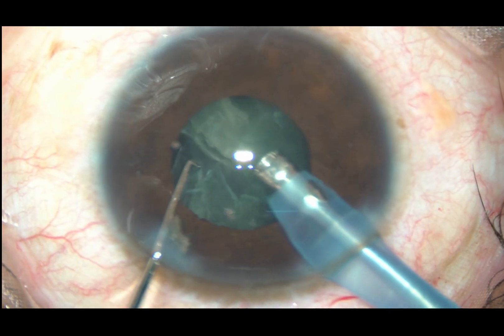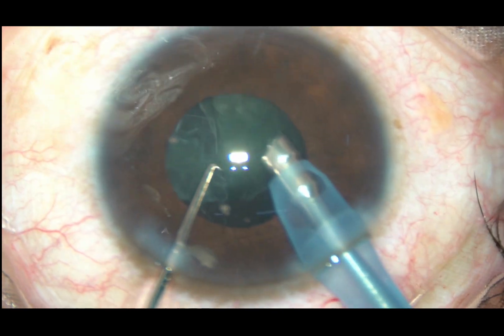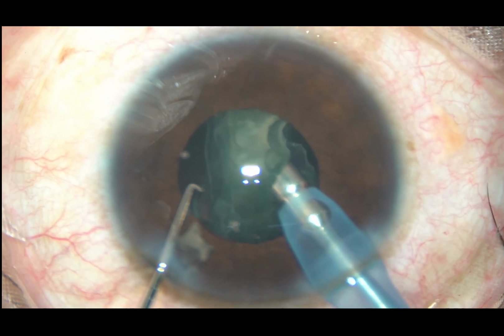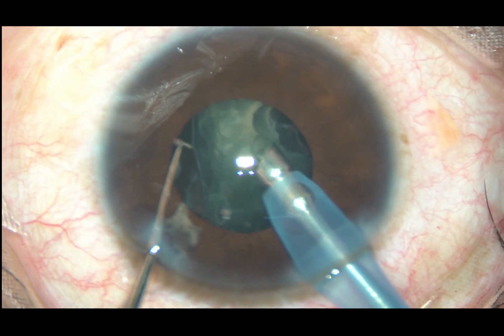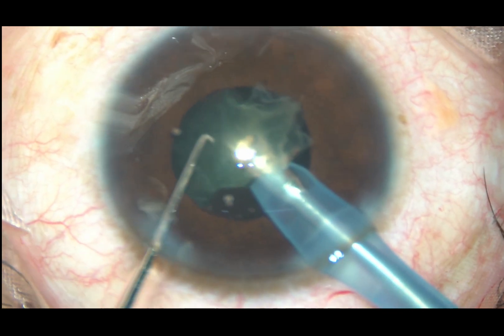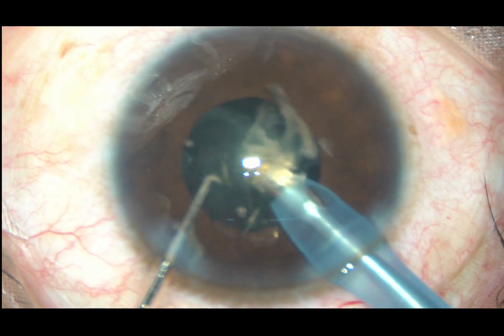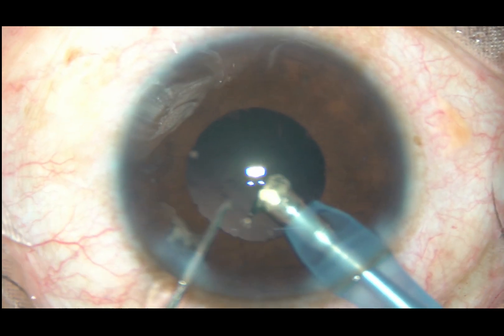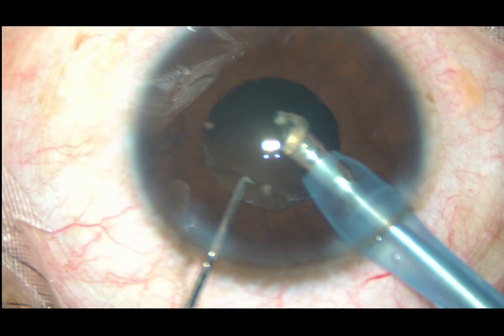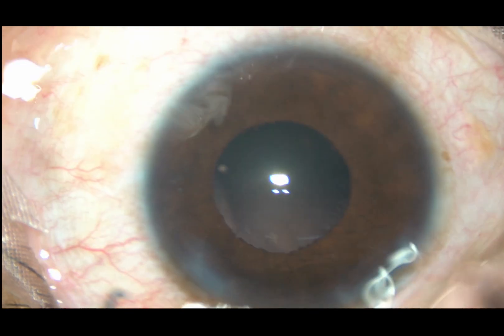Phaco power used in this case is 65 percent. Flow rate is 45 ml per minute. Vacuum is 450 mmHg. This is the last portion of the nucleus — it is emulsified and removed. The anterior chamber is very stable and I could manage the case very comfortably.